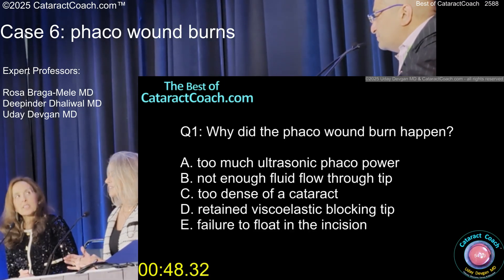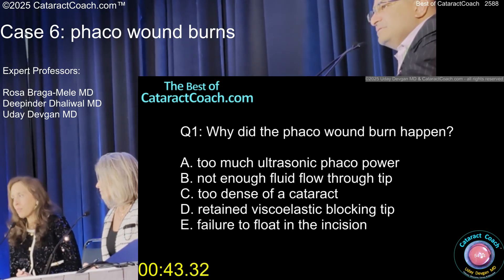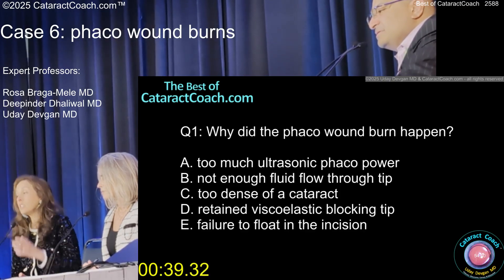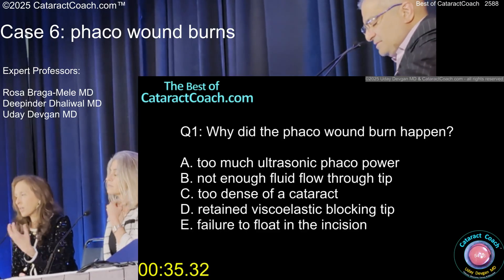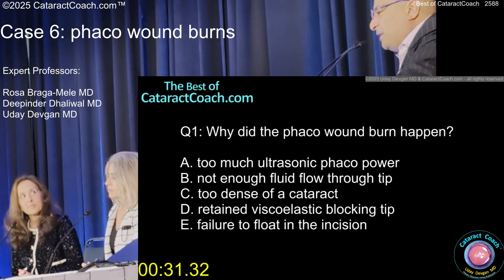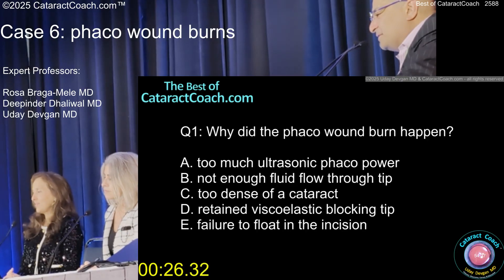You didn't cool the tip. The FACO needle is moving at a high frequency and heats up very rapidly. You need that fluid flow around it and you need to establish flow when you go into the eye. Make sure you're getting fluid exchange. And that lack of pivoting in the incision was just a killer — you can burn the cornea in a second with that.